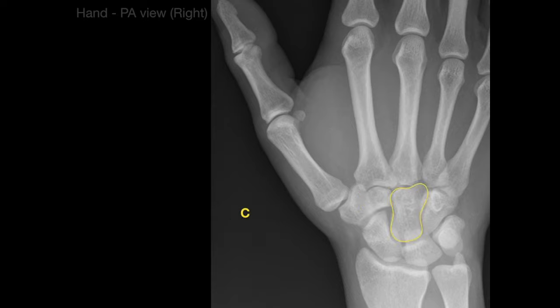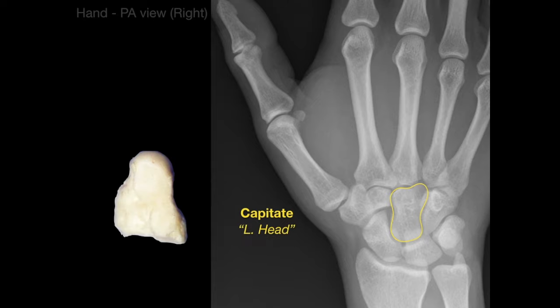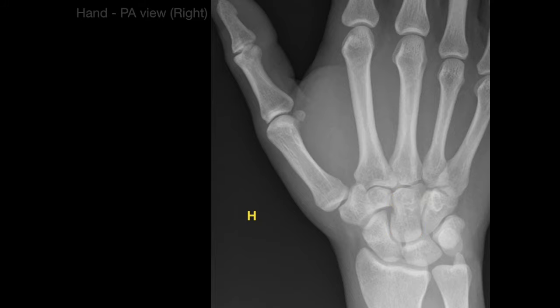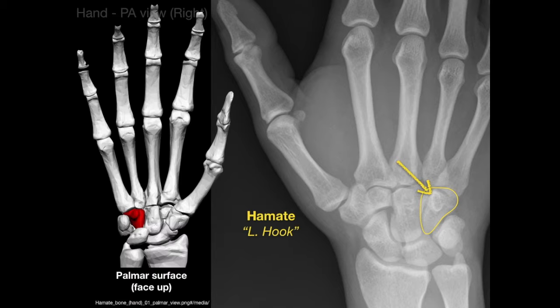C is for capitate, because capitate is Latin for head — there is the capitate bone, and if you look at it, it kind of looks like a head. The next bone is the hamate, which is Latin for hook, because that small structure is called the hamulus, or hook, of the hamate.